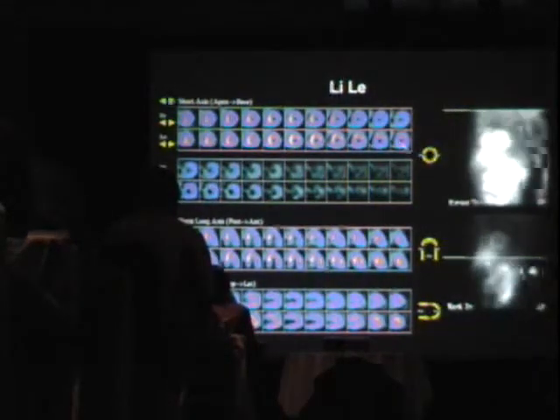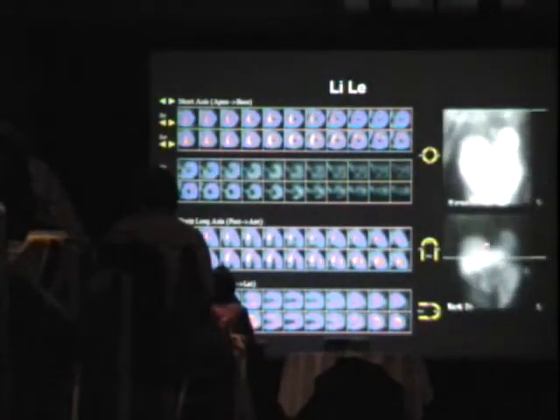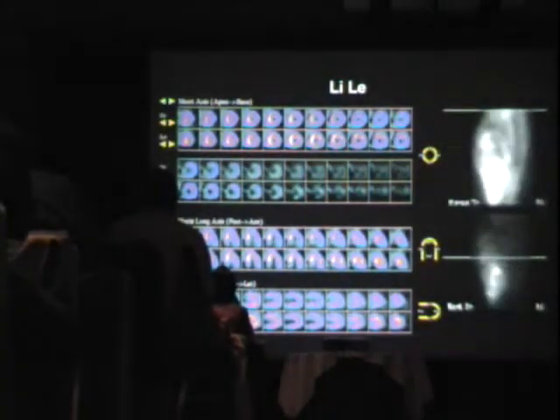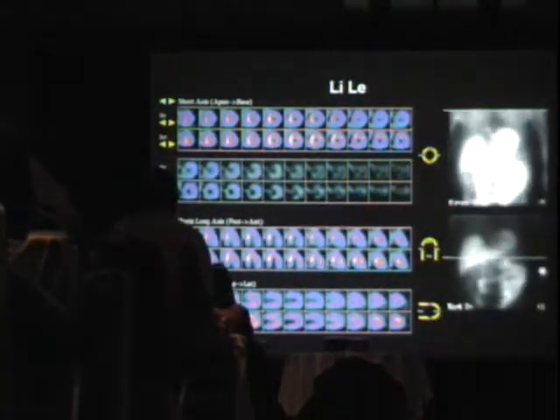To what extent is this defect a reflection of the arm in the field of view? Well, one reassuring aspect is that the arm was also in the field of view at rest, and because the resting study has a low dose of the isotope, if anything, we should have seen worsening of this pattern at rest because there's more attenuation. So it is a reversible defect. Again, the gating would not help you.